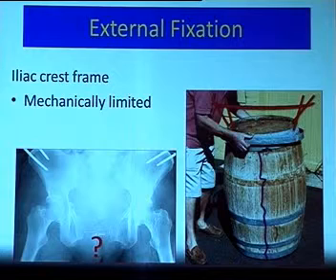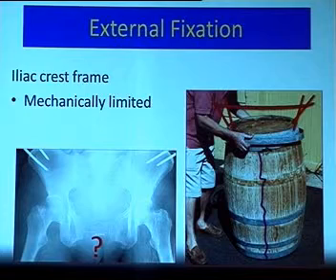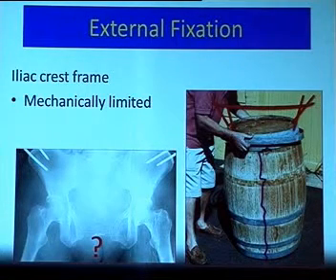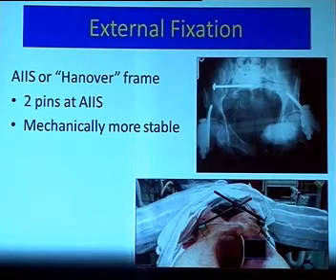And that's why you've got cases like the one on the left where there's a frame on, but really no reduction has been functionally achieved. And so this frame has lost steam and popularity. Much more common now is the Hanover frame, or the anterior inferior spine frame, or the supraacetabular frame. It's a 2-pin X-fix, which is usually fairly easily applied, but it usually has to be applied in surgery with a C-arm available. Mechanically, it's much more sound than the iliac crest frame, because it really is at the midpoint, the center of rotation of the barrel.